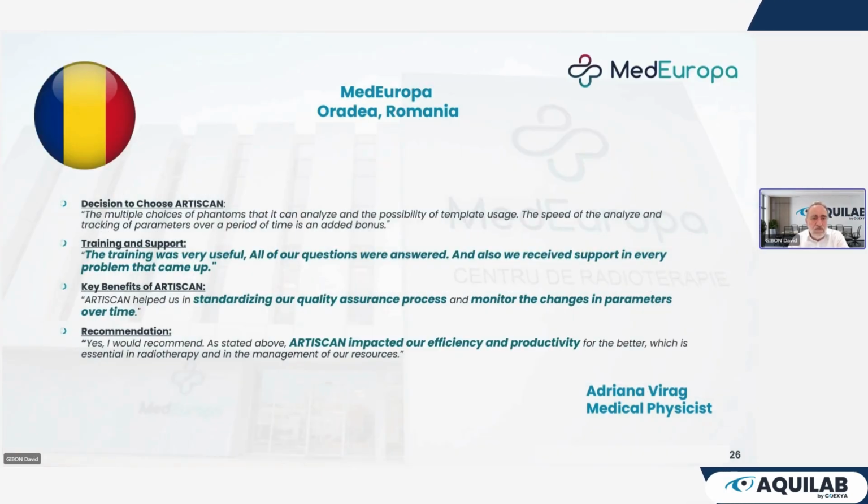The other one is coming from Romania, where they were also very happy with the training of the company, and the software permits them to standardize their quality assurance process, with a very good impact on efficiency and productivity of the QA process. So we are very happy to have this feedback from users.